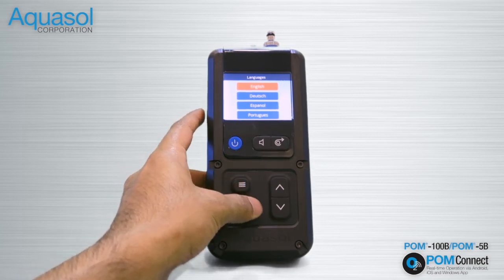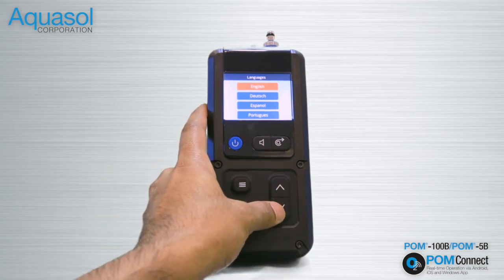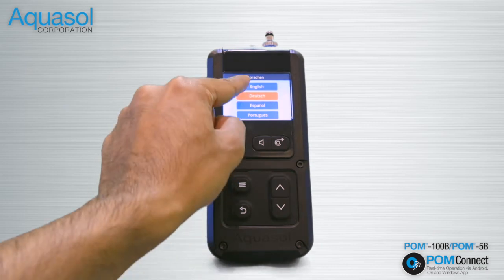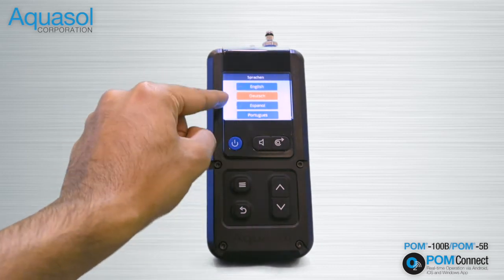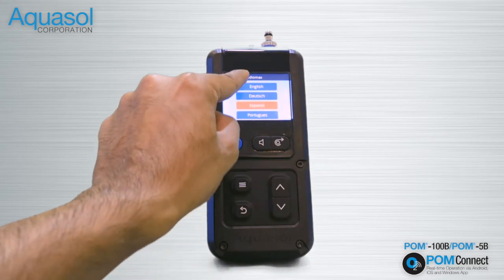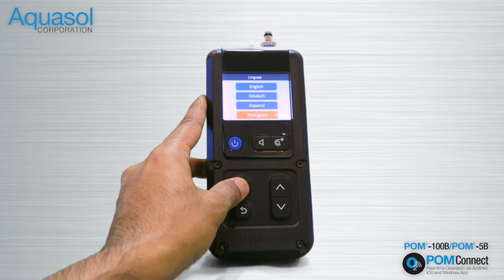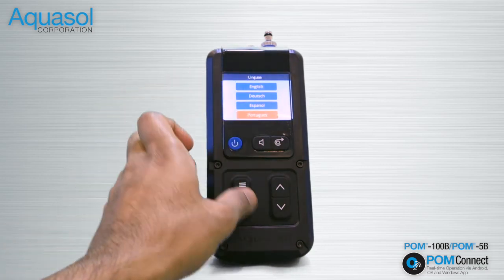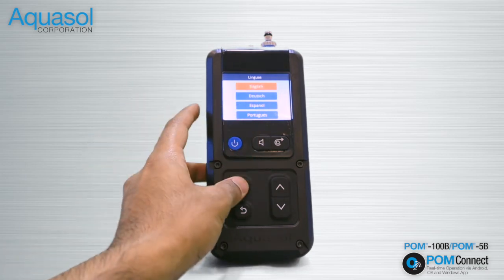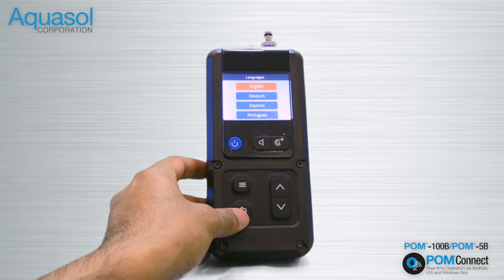Using the up and down arrow buttons, scroll and choose the desired language, then press the menu enter button. Press the back button to return to the main menu.